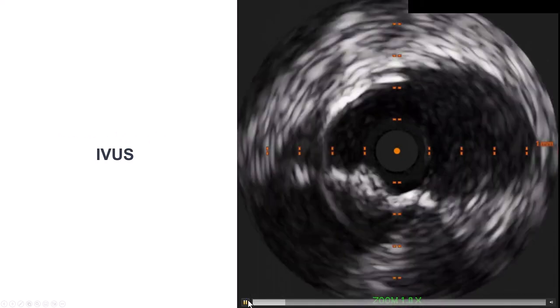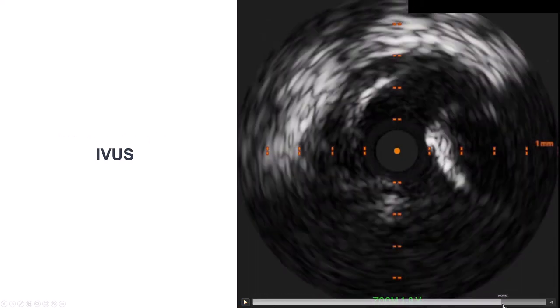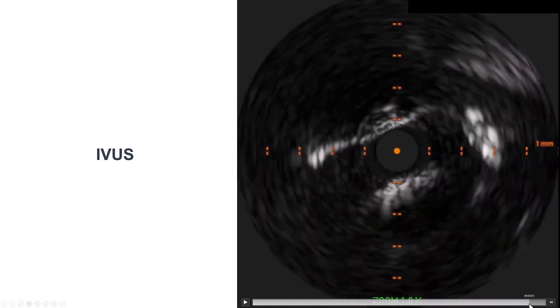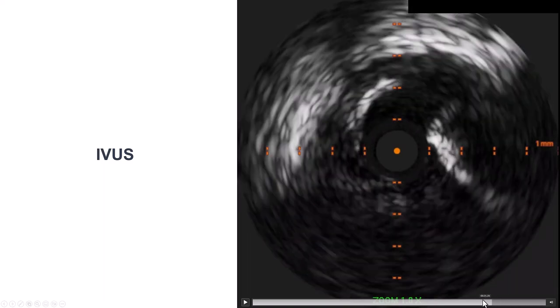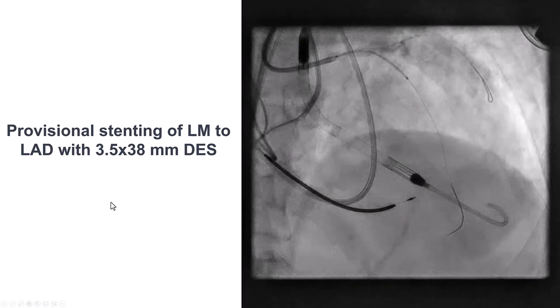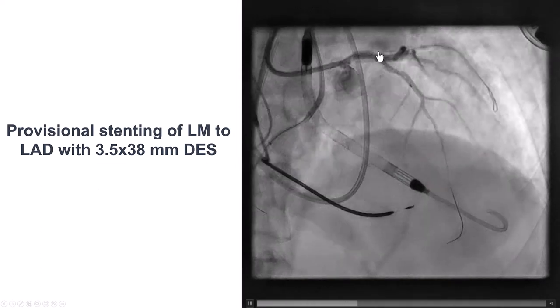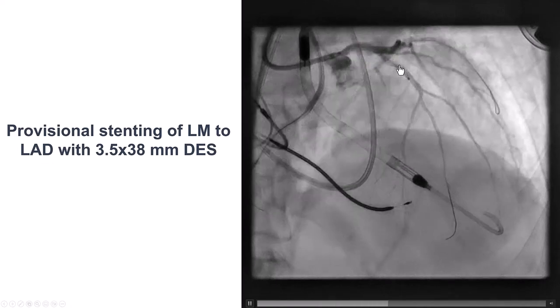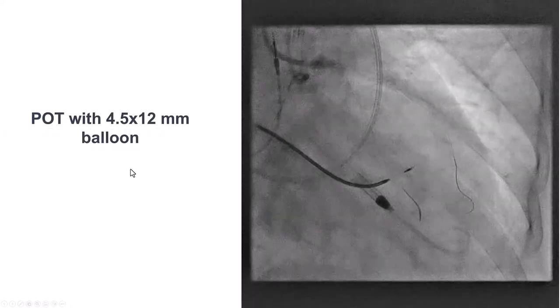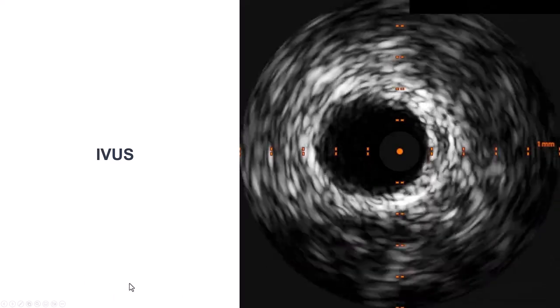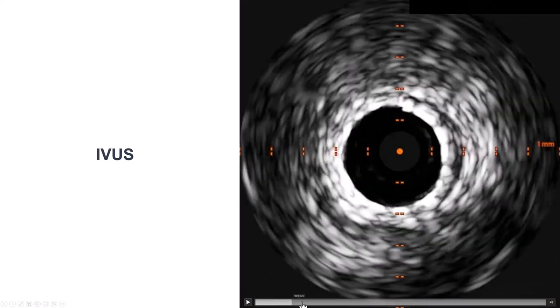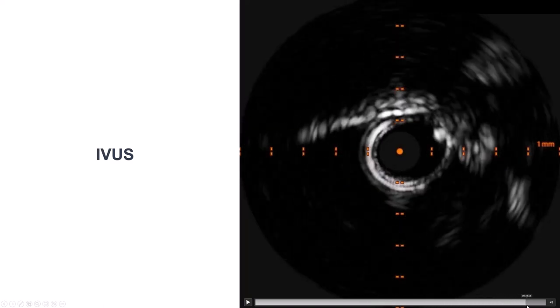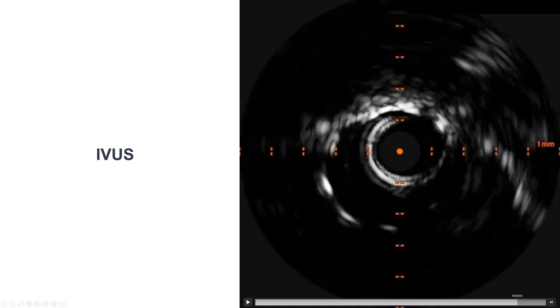We did intravascular ultrasound of the left system and found significant disease at the ostium of the left main. So we decided to stent the left main. We did stenting into the LAD, jailing the circumflex with a drug-eluting stent. We performed proximal optimization and then repeat intravascular ultrasound. The stent appears well expanded and extends all the way into the aorta.